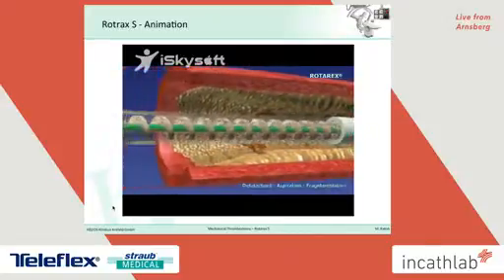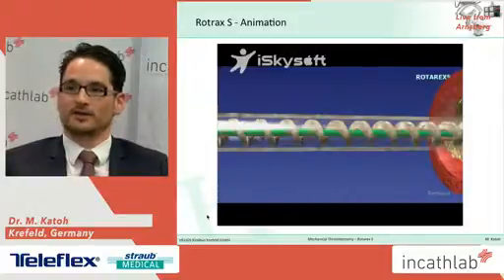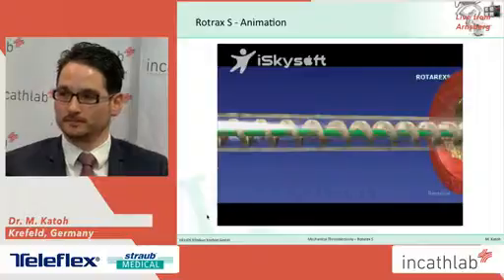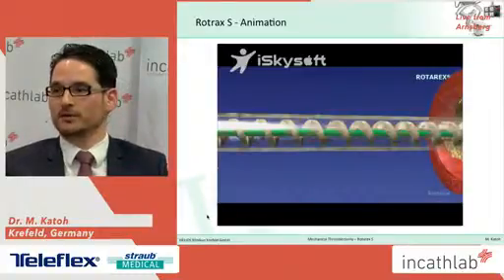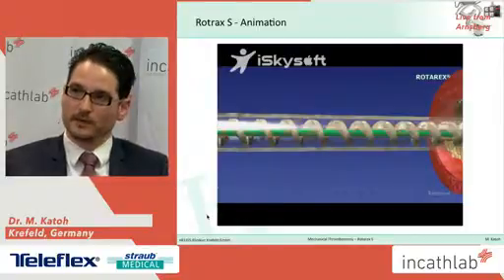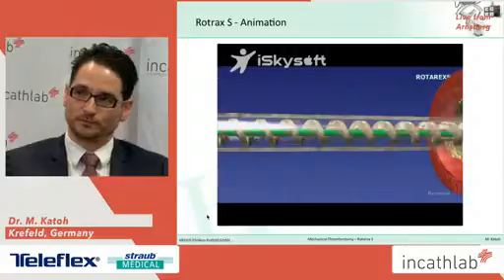The detached thrombus material gets aspirated into the catheter by the vacuum inside the catheter and gets fragmented by the shearing movement of the two cylinders. And finally, all the material gets aspirated and removed out of the body according to the principle of the Archimedean screw.